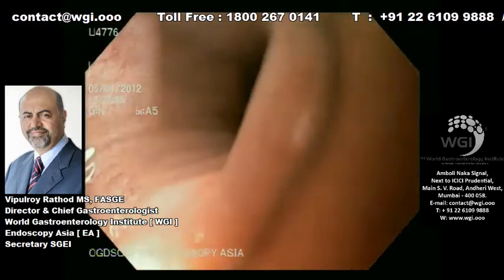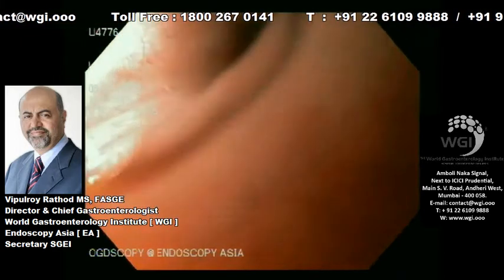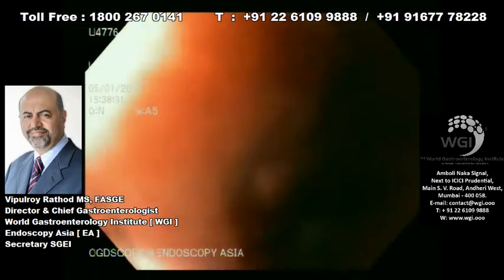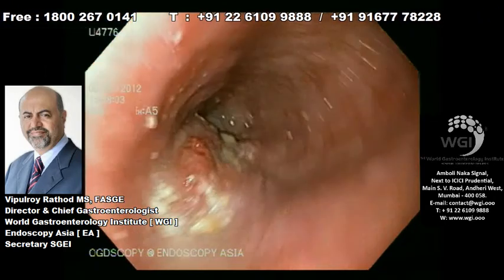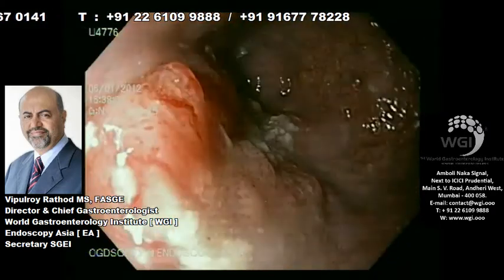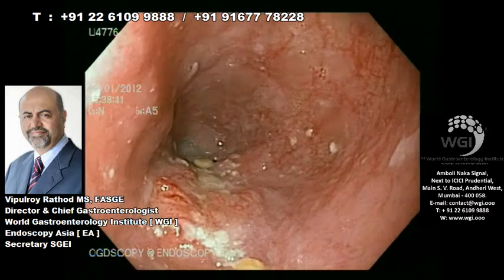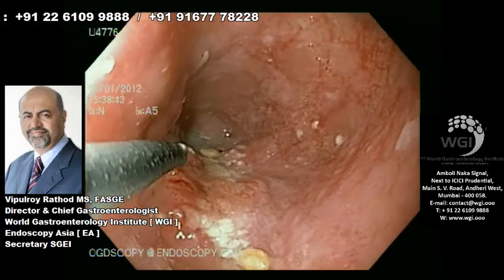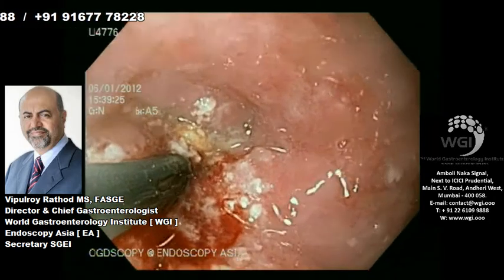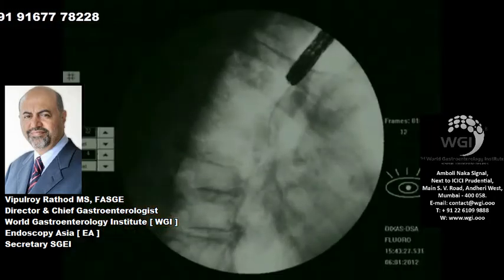Over 2,000 esophagus cases that we have staged so far, we never had an opportunity to say we can't go across a stricture. It's always possible to go across any tight stricture such as this if you use the correct accessories. Here we are going to use a biliary dilator with a hydrophilic guide wire like a Terumo.